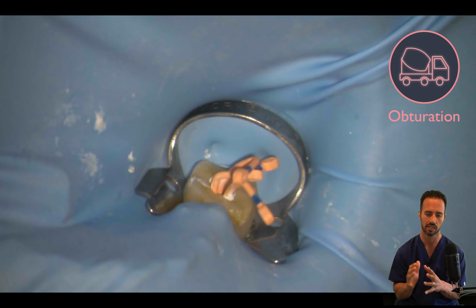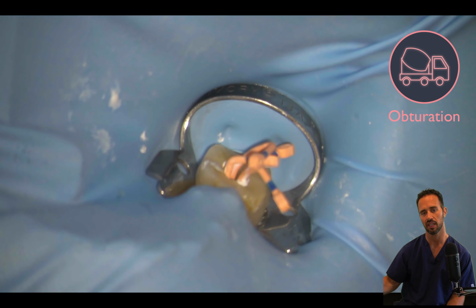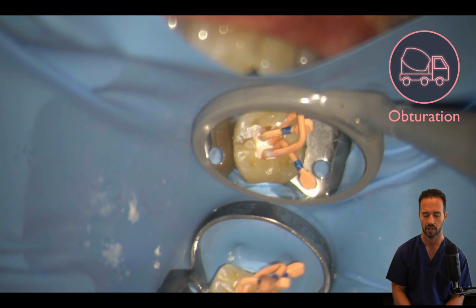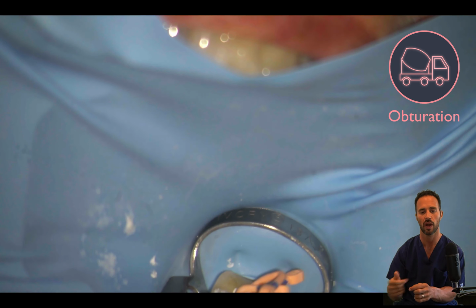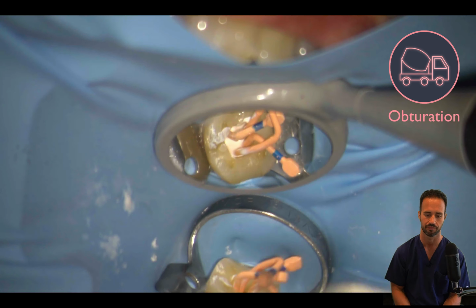And once we've obtained that radiograph and we're happy, then we're going to go ahead and get our System B heat tip. Again, this is the Buchanan Fine Medium 08 tip. We're going to introduce it in, and we're going to start severing these gutta-percha cones right at the orifice level in preparation for our compaction.